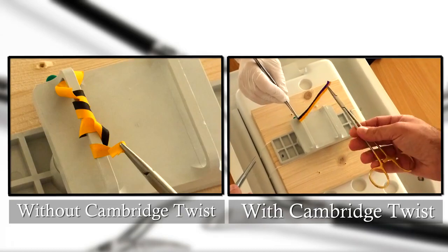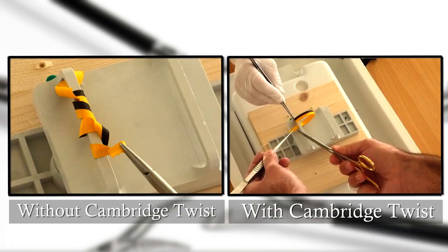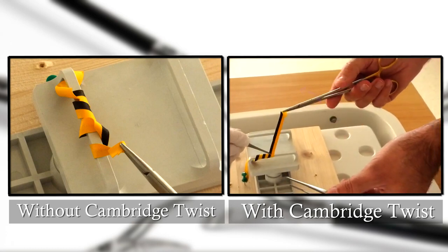On the right side of the screen, the needle holder is turned after every pass. This results in a smooth running suture.